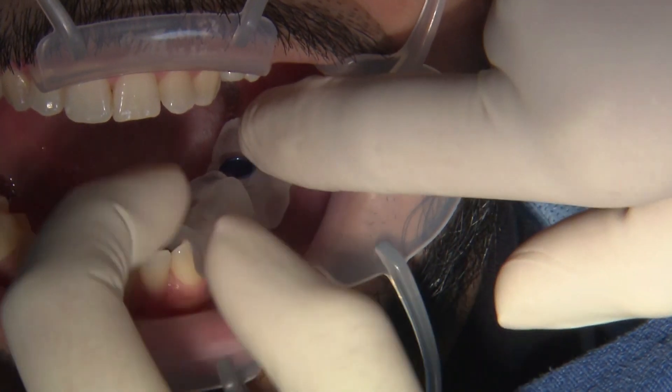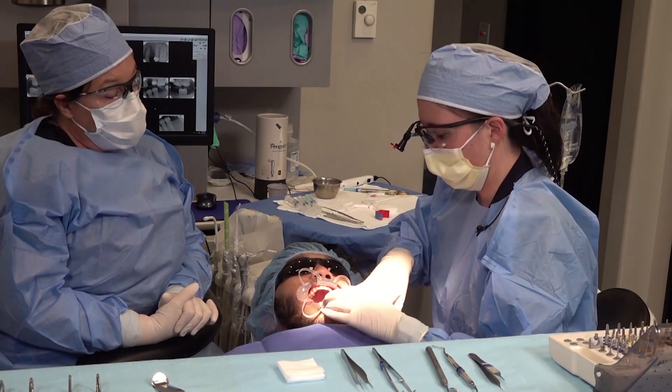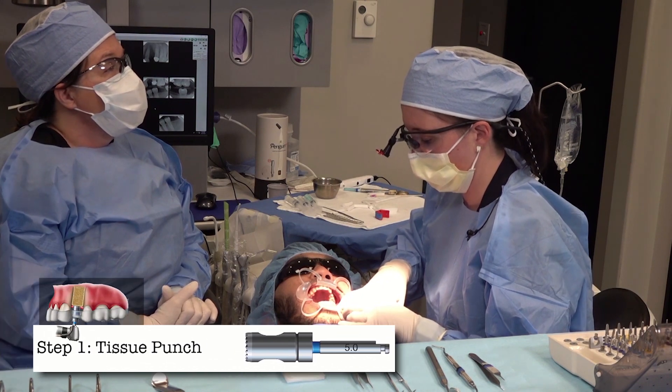You're looking to make sure that it doesn't rock — we don't want any movement of the guide. We're going to go ahead and do our tissue punch drill first.